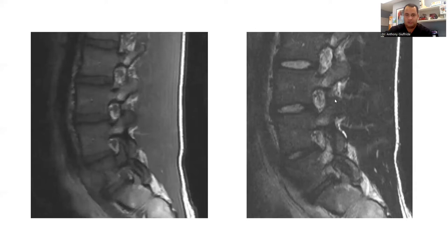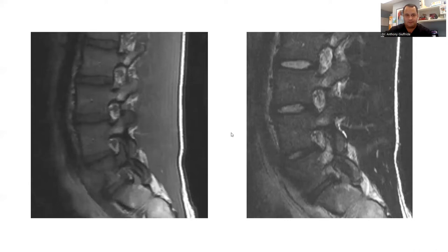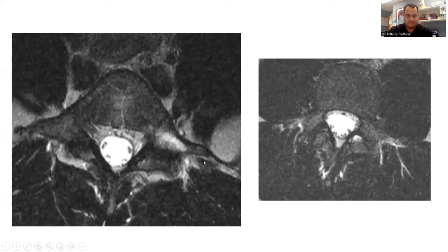Here's the T2. One thing I want to point out — my good friend Doug Beal also noticed this on LinkedIn — there is what looks to be some edema at the other junctions as well, at L2, L3, and L4. What I didn't post was the T1. The T1 points me more in the L5 direction, but that was interesting to me when I first saw it, and it's something I may dive into more after the LinkedIn discussion. This is the axial view at L5, and obviously we see that big stress reaction in the pars area.